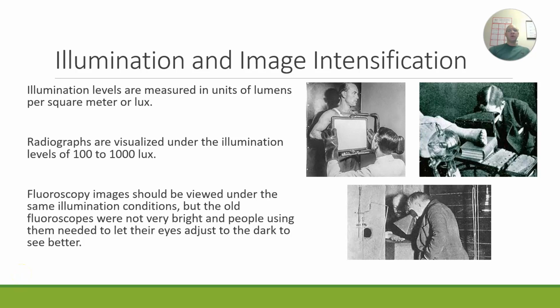This is RAD104 and this is lecture 1.2, and we're talking about fluoroscopy and fluoroscopy equipment. In ending my last lecture, my last video anyway, I mentioned something called lux, and I just wanted to define what that is.